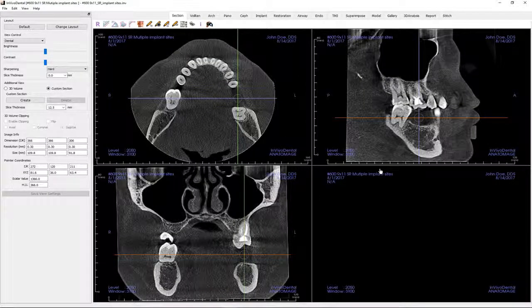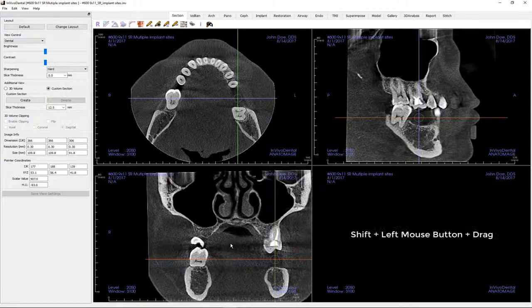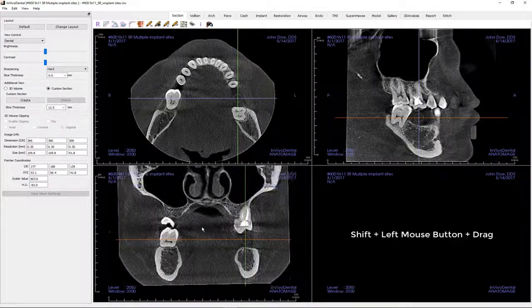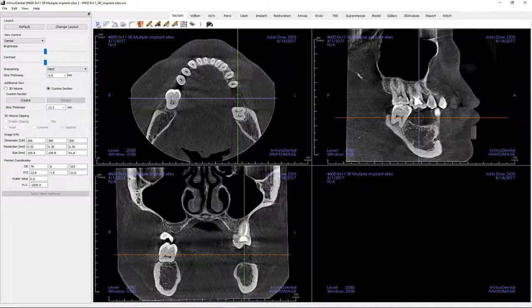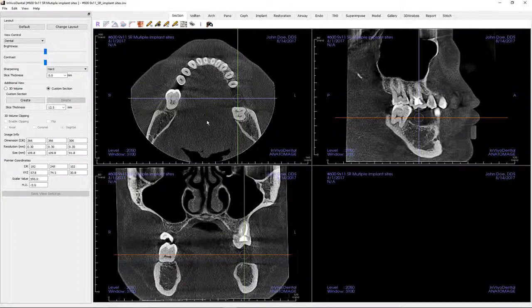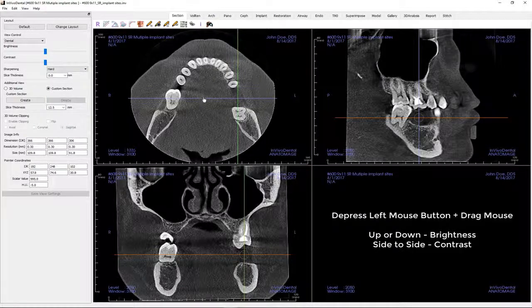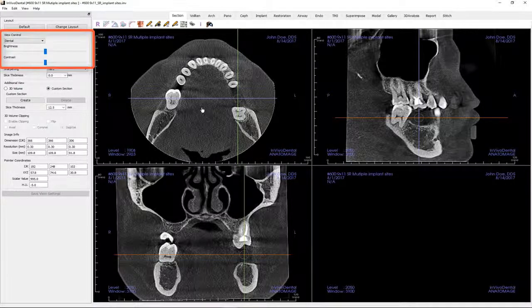You may want to move or pan the image on the screen. To do so, move your mouse cursor to an image, depress the Shift keyboard key and the left mouse button, and move your mouse. As with the zoom feature, you may click the toolbar's Reset View to revert back to the default position. To change the brightness and/or contrast of the image, depress the left mouse button and move your mouse up or down for brightness and left to right for contrast. This can also be done using the view control tools in the control panel.